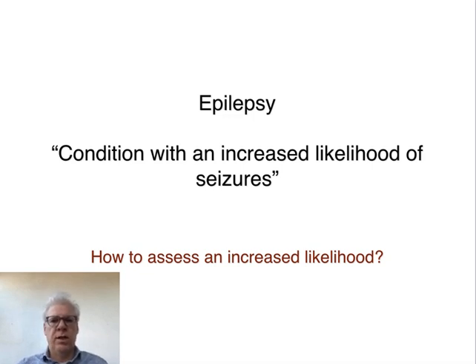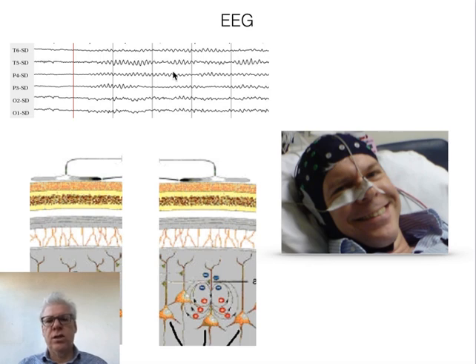And one very important measurement tool is the EEG, the electroencephalogram. So what's an EEG? Well, an EEG is essentially a recording of the electrical activity of the brain, and this is possible, fortunately, through the intact skull. So you can place electrodes on the scalp, and when the brain is functioning properly, you will be observing brain rhythms in the frequency range I just told you. And very often the most dominant rhythm, particularly with the eyes closed, is in the alpha range between 8 to 13 hertz.